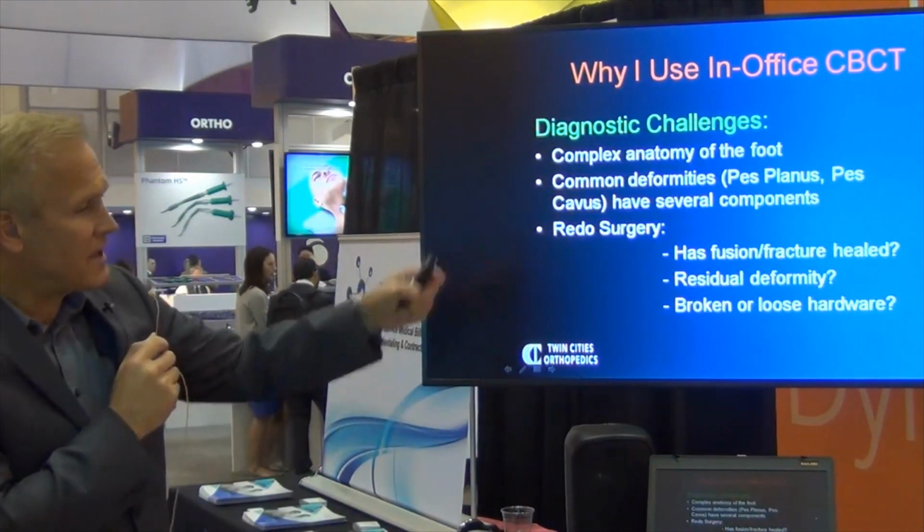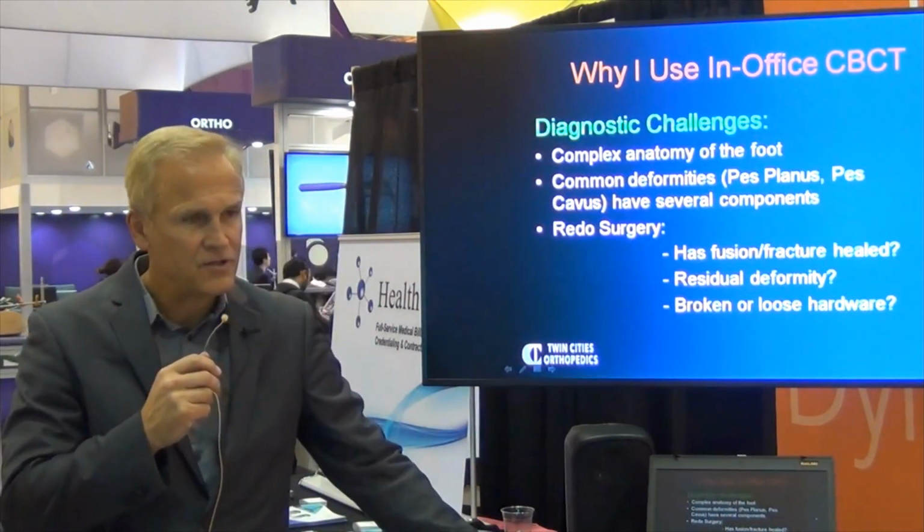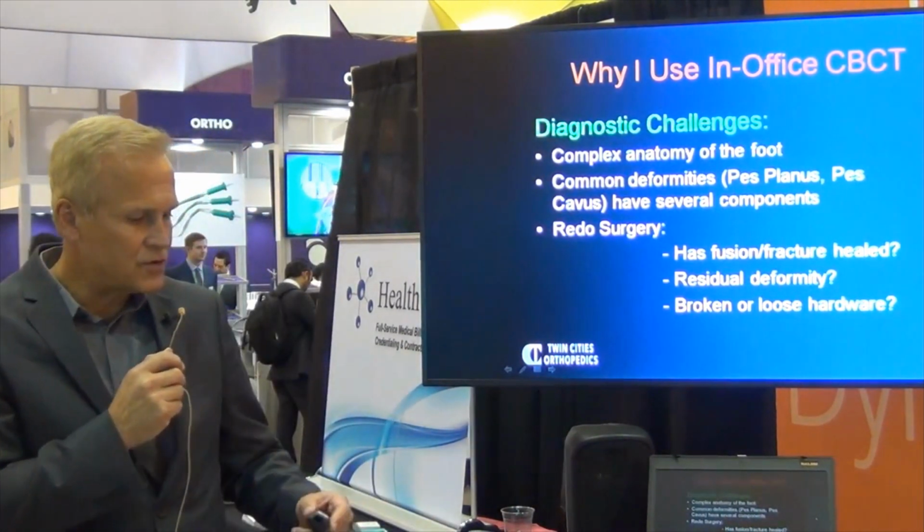But I use it because we really have diagnostic challenges as foot and ankle surgeons. Dr. Canali here with me is one of my co-fellows way back in the early 90s. The foot and ankle anatomy is very complex. There are a lot of joints in the hindfoot, namely the subtalar joint, talonavicular joint, and also Lisfranc's joint, that are very difficult sometimes to read on X-ray, such as how much cartilage is left in those joints. For example, the subtalar joint is a saddle joint, so it is difficult just on a lateral view to see across that joint to see how much cartilage you have and how much is still remaining, or if there's any kind of osteochondral lesion or failed fusion, etc.